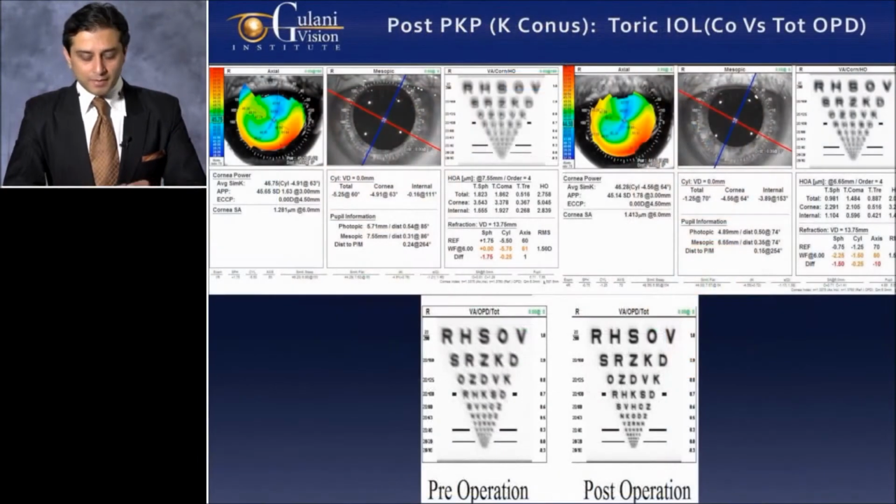to better outcome. And if you see the same patient in the next slide, you see here how the OPD shows us that the visual quality is poor with this transplant. But overall, total OPD of this patient, including the cornea, is actually excellent. So overall, the patient, despite that transplant, is seeing 20/25 and is thrilled with his vision and the freedom after so many years.